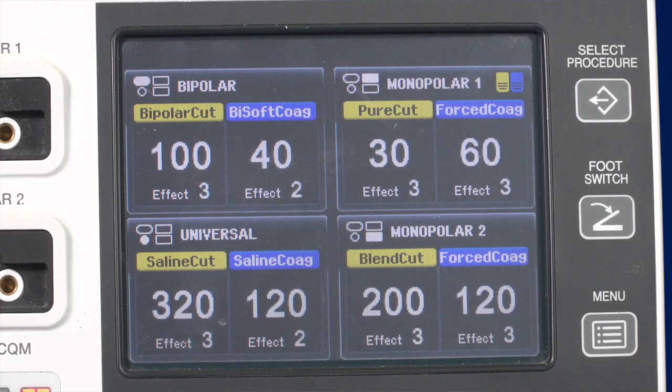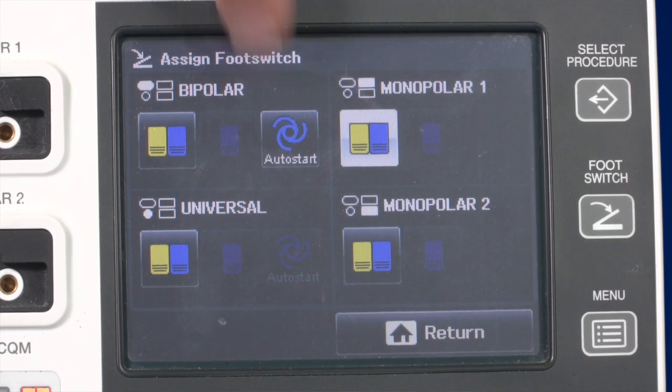Bipolar energy is mainly used for coagulation. The main bipolar coagulation modes used in standard surgery are Bisoft Coag, Autocoag, and Hard Coag. Bisoft Coag is the standard bipolar coagulation mode to be used with bipolar forceps and offers the option to assign an autostart function, which is assigned in the footswitch menu. Autocoag is the same as Bisoft Coag but with a built-in autostart function. Hard Coag is used in combination with larger instruments if vessel sealing is required.